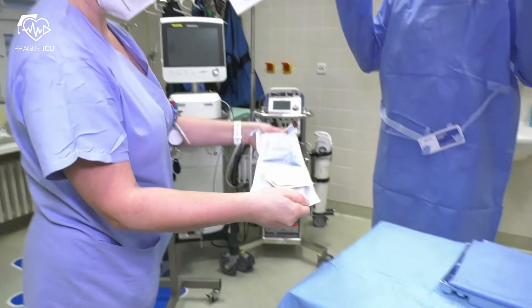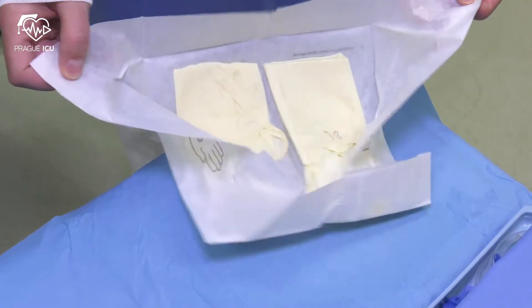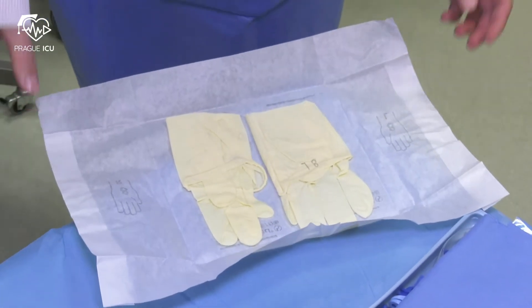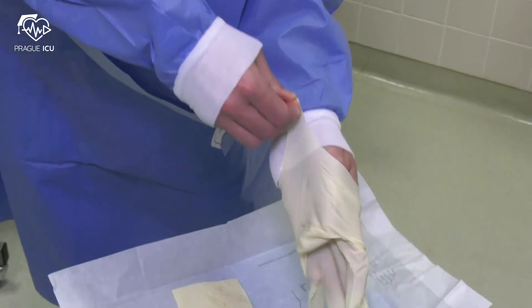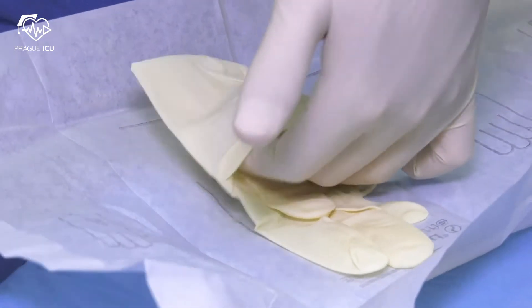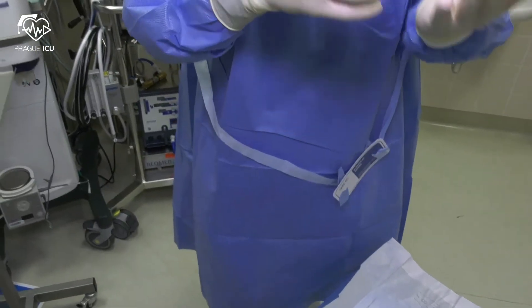Then open the inner glove packet from the sterile field. Pick up one glove by the folded cuff edge, insert your hand inside and pull the glove onto the hand. Then continue with the other hand. Adjust the fingers of each glove as necessary so they fit appropriately.